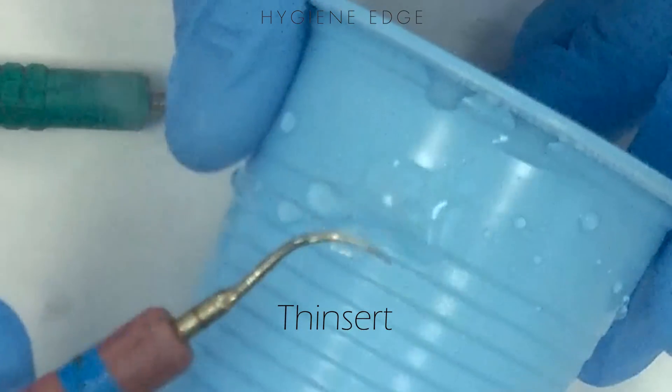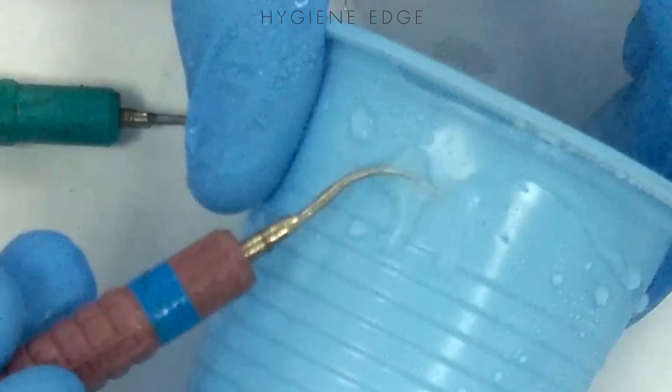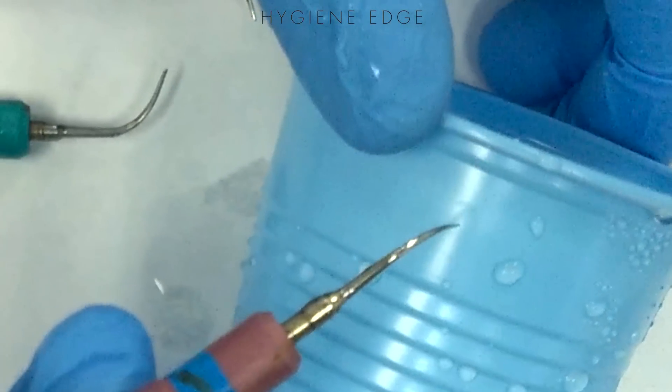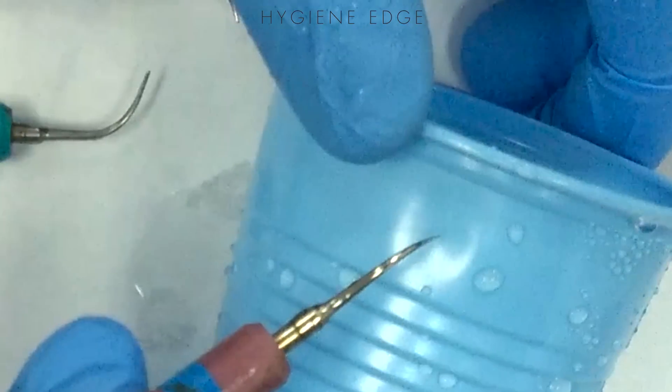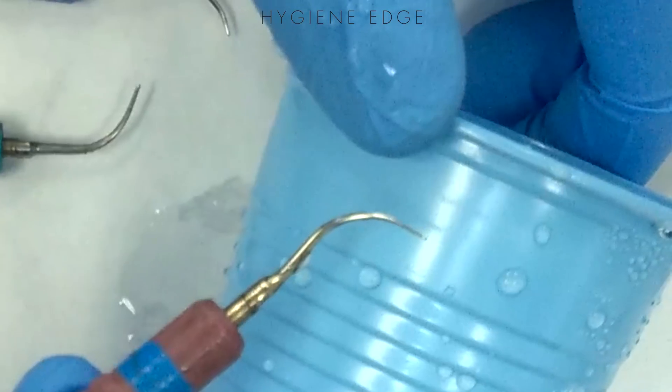If it takes a long time to make a hole, it's probably too short or bent. Don't test the straight tip, because that's where the strongest power is and you're not going to use it on the tooth anyway. You want to use the last tip third, like how you would use it in the mouth.